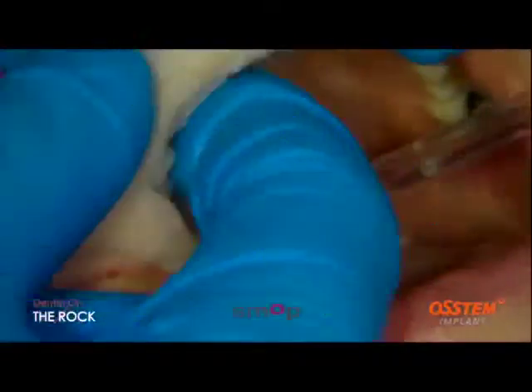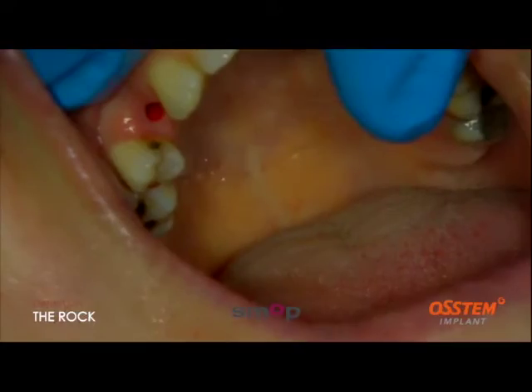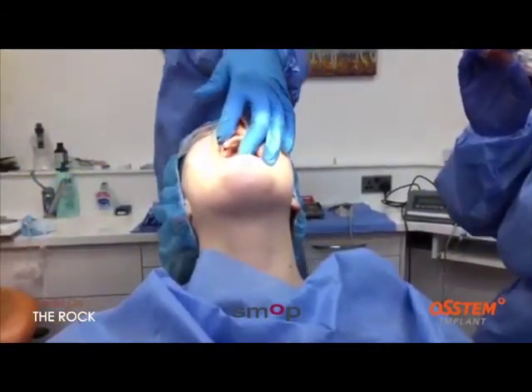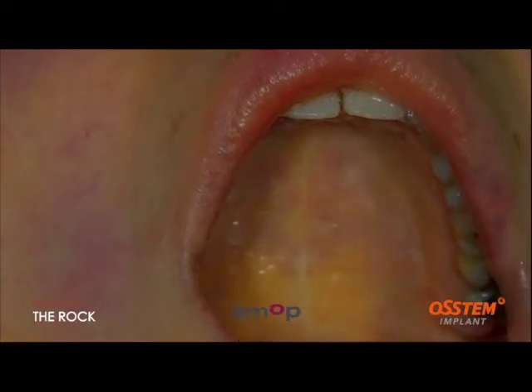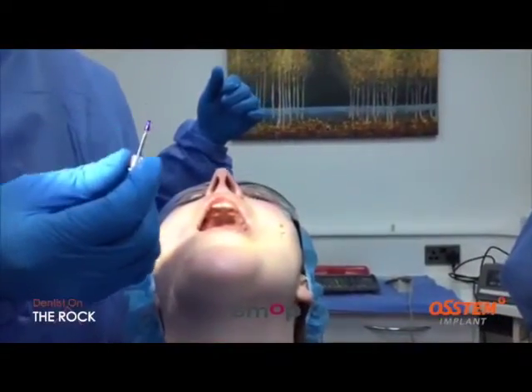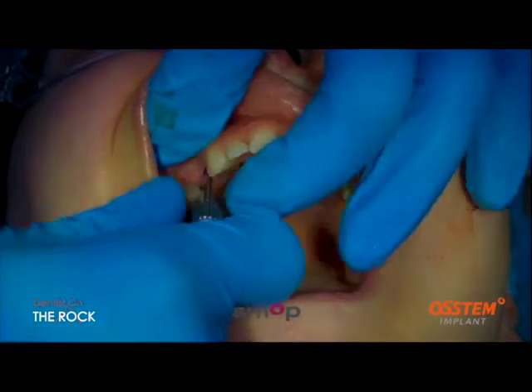So, I'm going to be placing a cover screw, a long cover screw, that's going to sit under the gum a little bit. The cover screw there. Take that in.